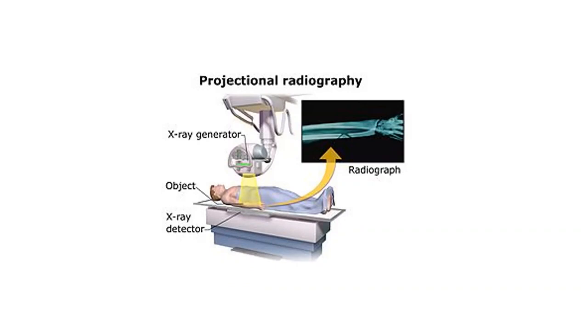But basically you have an X-ray generator, which is usually a tungsten filament that basically has a capacitor charge, lets this release into the filament, and then you get a discharge of X-rays, okay? You have devices inside of the generator that try to collimate that, prevent scatter so that the beam goes in one direction. And then you have a detector, and that used to be a chemical film, all right?